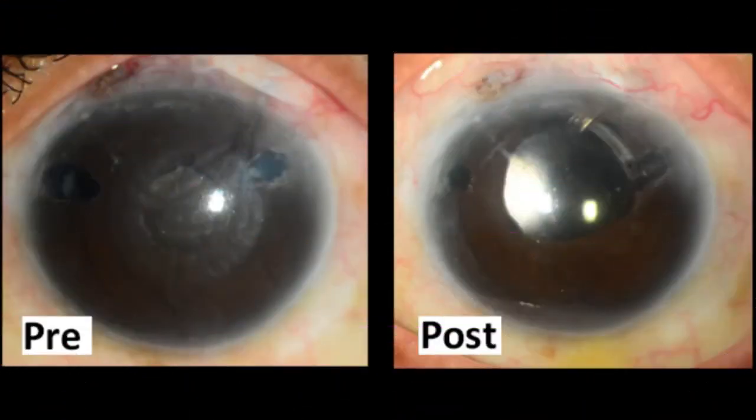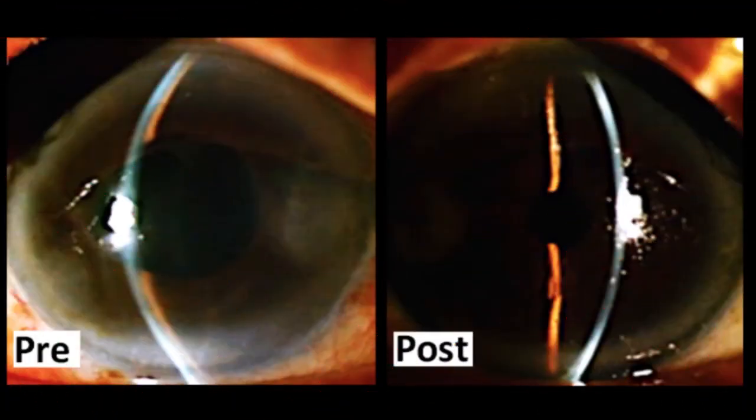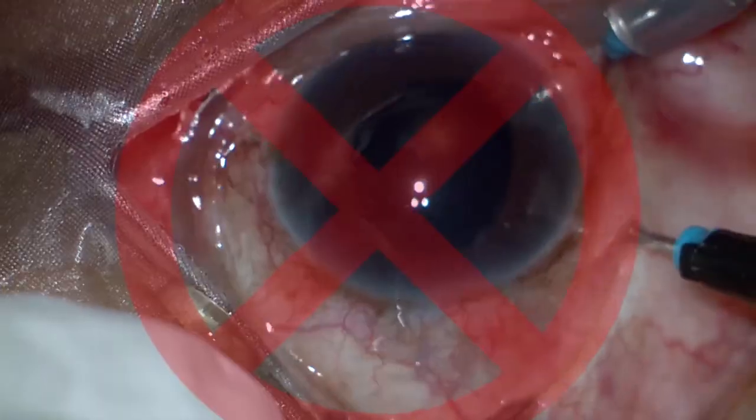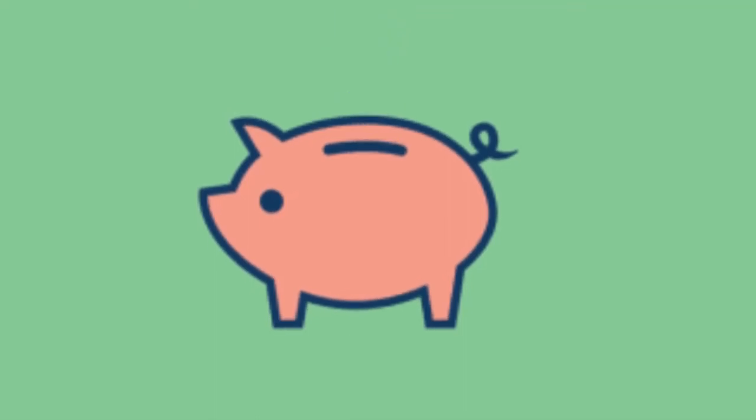To conclude, Irido-Zonulo-Hyaloido-Vitrectomy leads to complete resolution of aqueous misdirection. It is a useful technique in the armamentarium of an anterior segment surgeon to manage medically recalcitrant aqueous misdirection syndrome, eliminating dependence on vitreoretinal procedures, their cost and scale.